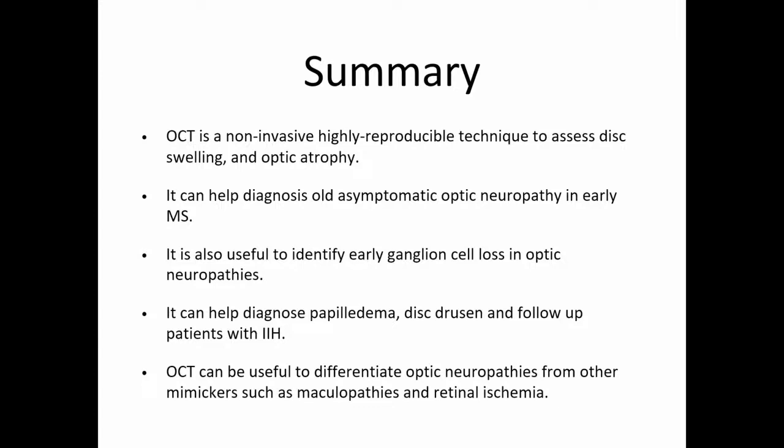OCT can also help you diagnose papilledema, disc drusen, and follow up patients with IIH. And it's also helpful to differentiate optic neuropathies from non-optic nerve diseases, which can present with visual loss. Thank you.